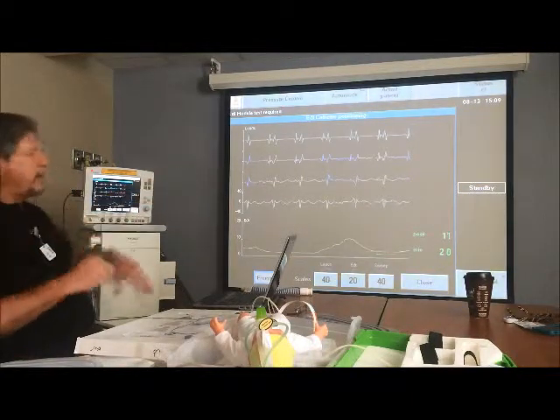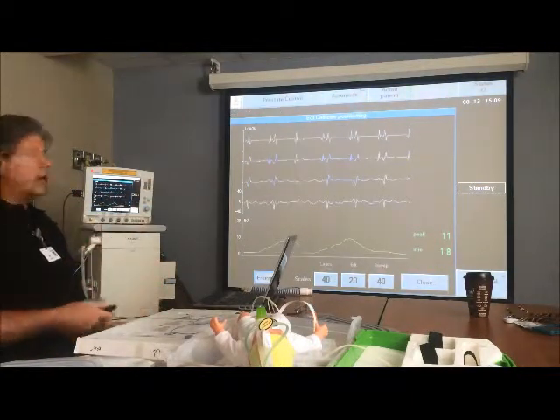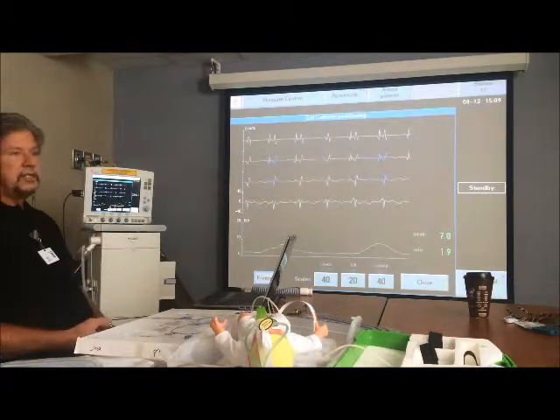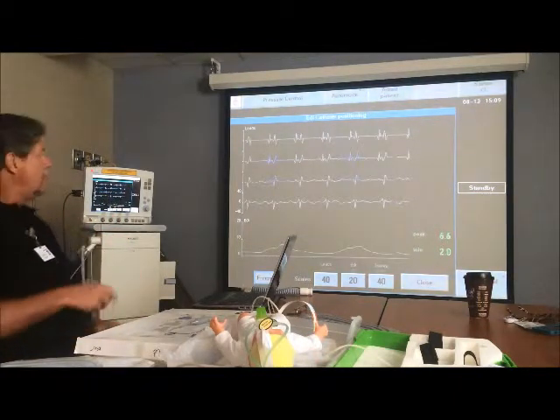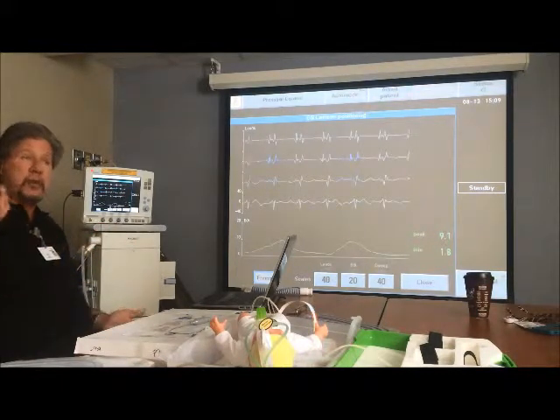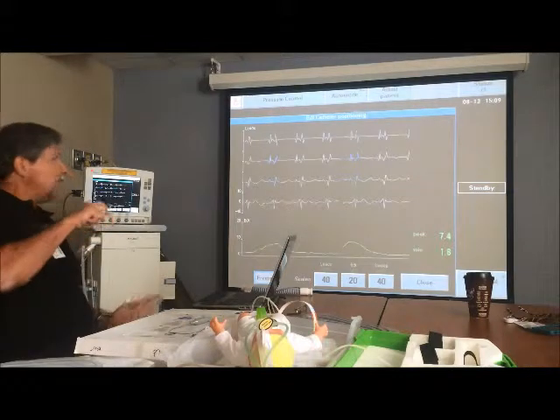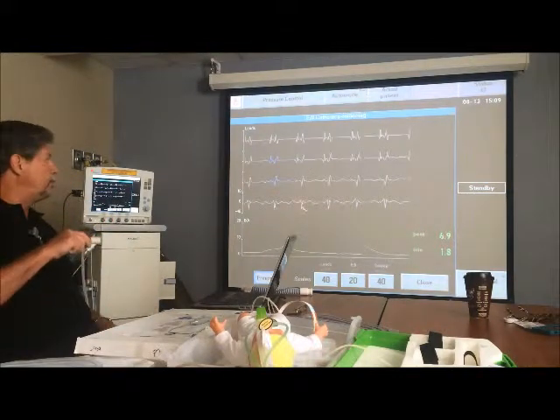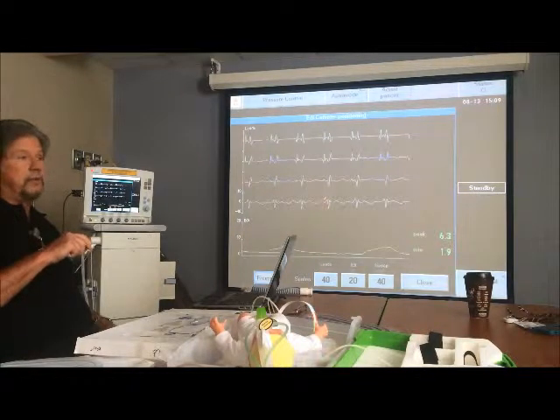So when we see that, we go, all right, we're in the ballpark, right? Now, where is the blue? Well, the blue is in the middle, okay? So we don't have to move the catheter. But if the blue were down, which is the case 90% of the time when you put the catheters in and the patient does have a spontaneous effort, you'll probably see the blue at the bottom too.